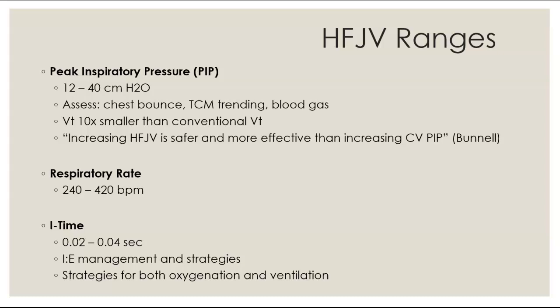Tidal volume is 10 times smaller than the conventional tidal volume. So they're itty-bitty. They're teeny-tiny. They're 1/10. But because we are giving those smaller tidal volumes, it is, per Bunnell, safer to increase the high-frequency jet ventilator PIP, and it's more effective than increasing the PIP on a conventional ventilator.